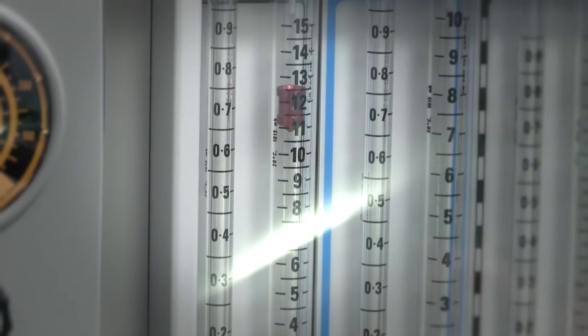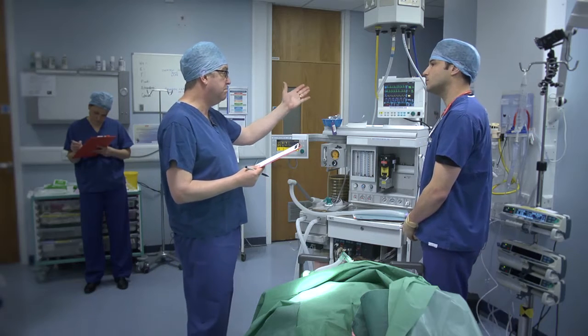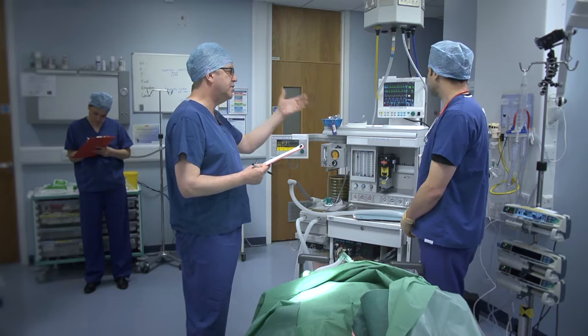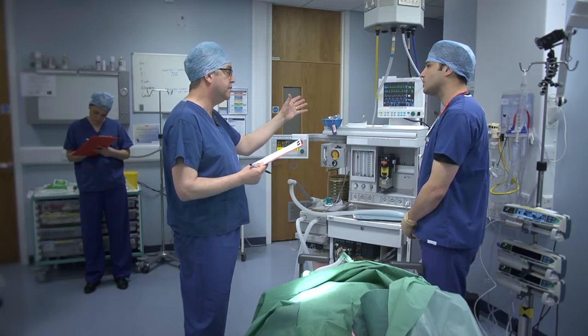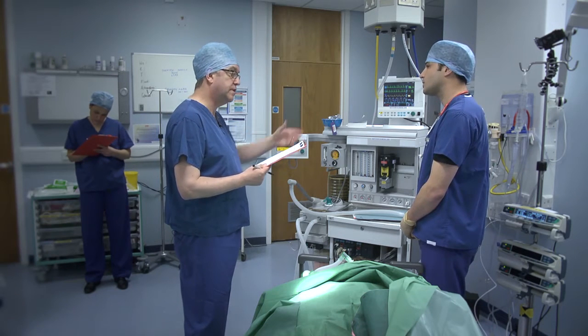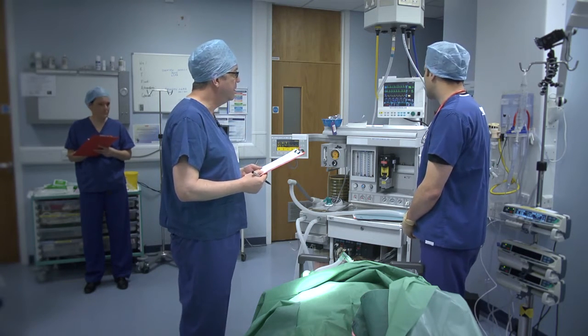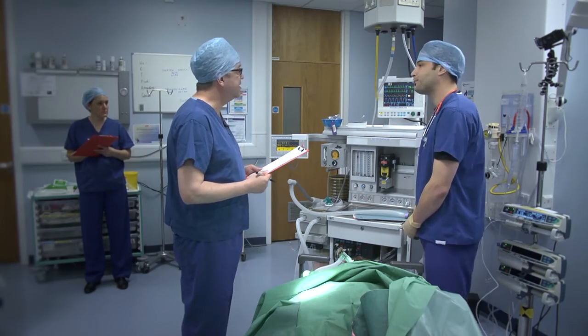Some questions. When you looked at the patient monitor, how easy or difficult was it for you to tell that the oxygen saturation had dropped? I found that quite easy. It was quite clear from the graph that it was coming down. So it was easy and it was clear from the graph.